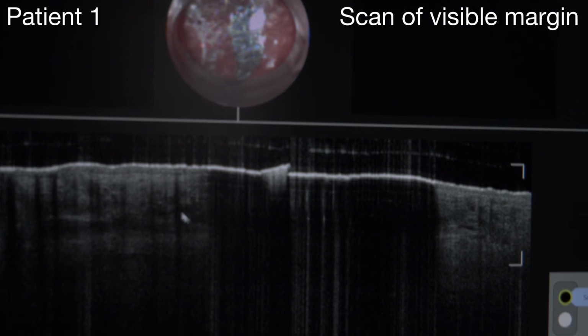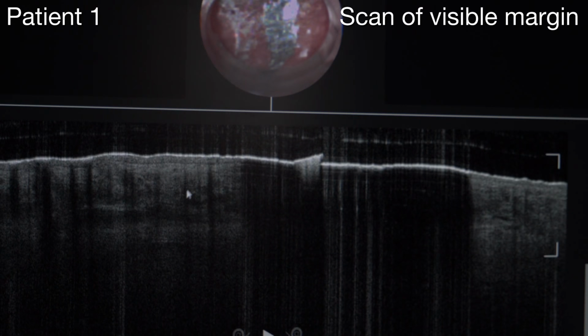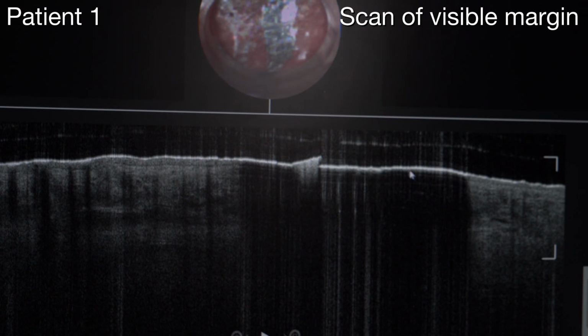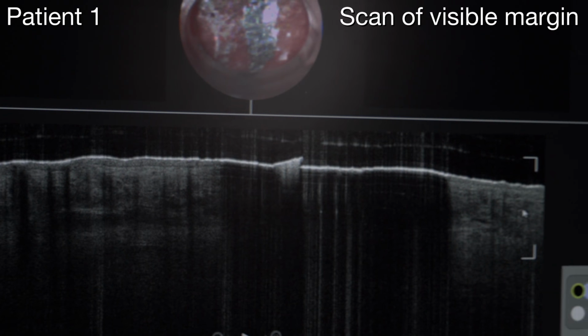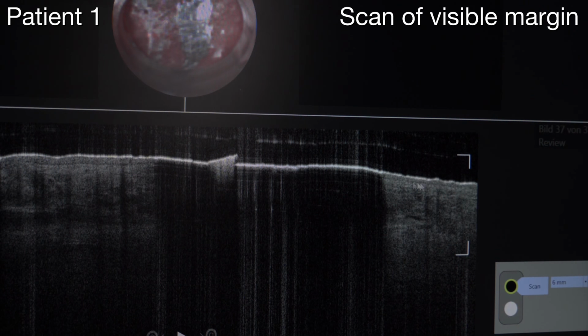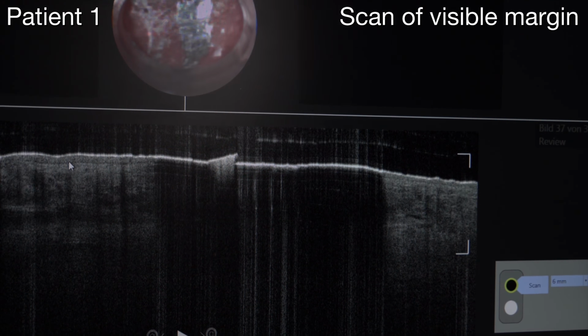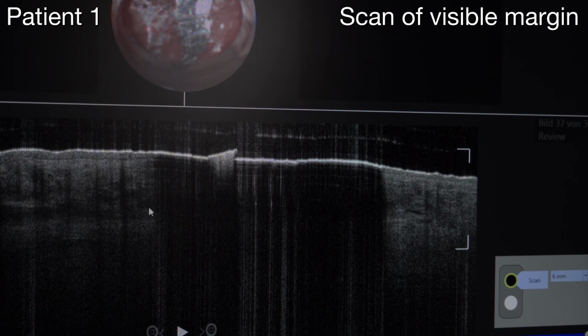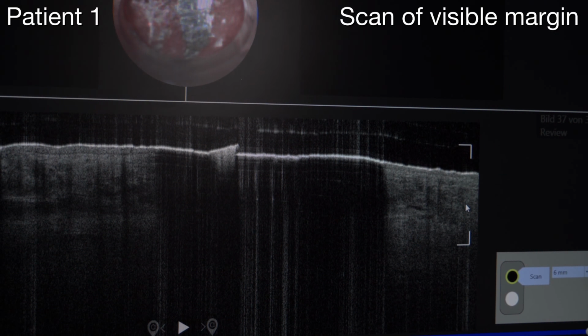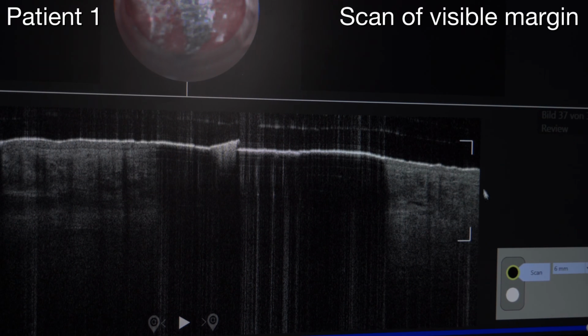And here in between we can see some tumor islands, and also here and here. And if we move on to the healthy skin on the right side, there's nothing left, no typical structure, a nice epidermis. So here we can also see a nice epidermis, but this is crucial. So we also have to look for the texture and the structures, and in my opinion this one is clear.